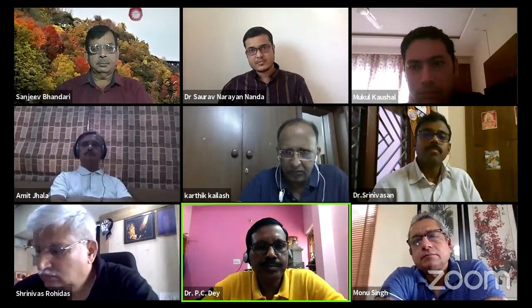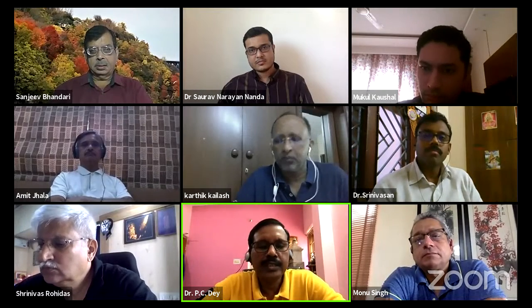There are a lot of things I learned gradually. This presentation, Dr. Saurav, was a study up to 2015. I think it is another 5 years past now. The recurrences, I think, are minimized very, very much nowadays. Almost within these 5 years, I have not had a single case of recurrence. With the visualization, we are putting the telescope inside the disc space and finding any loose fragments, so that's why the recurrence rate is drastically reduced.